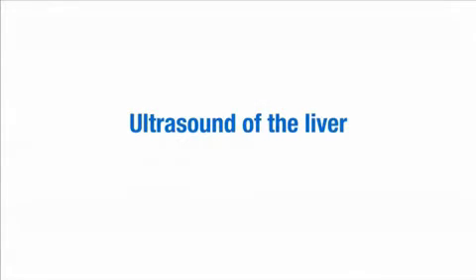This video demonstrates how to set up and perform an ultrasound scan of the liver.